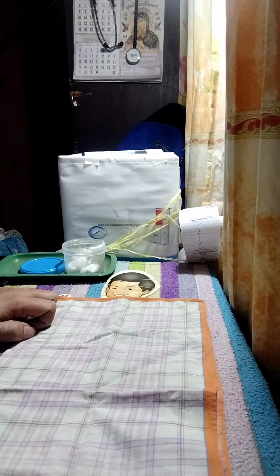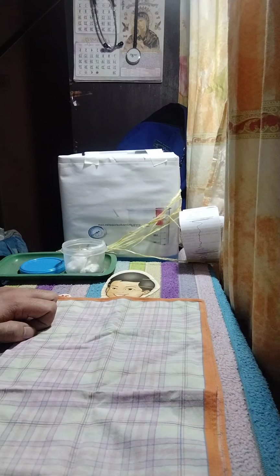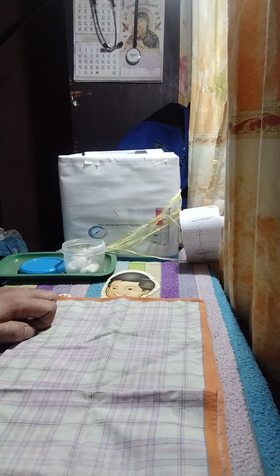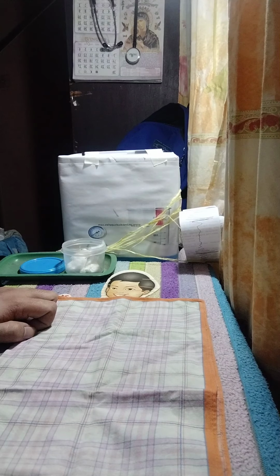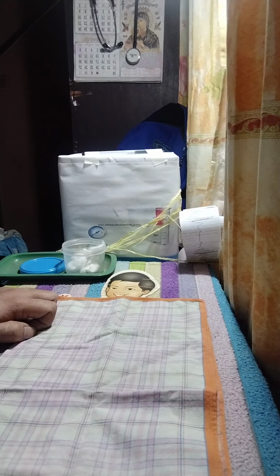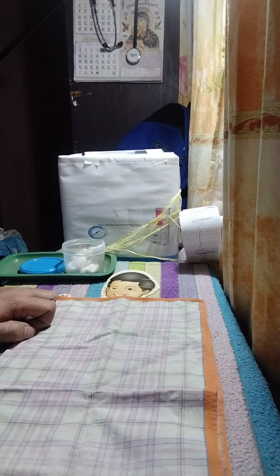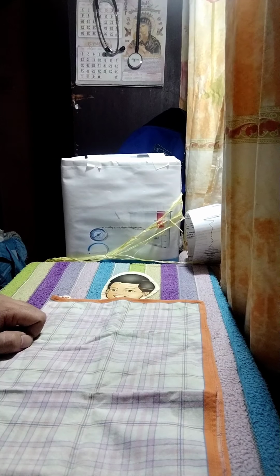Next, clean the ECG machine per facility policy. If not done electronically from the data entered into the machine, label the ECG with the patient's name, date of birth, location, date and time of recording, and other relevant information such as symptoms that occurred during the recording. Next, remove additional PPE if used and perform hand hygiene.